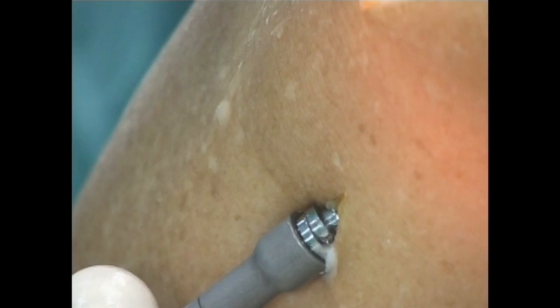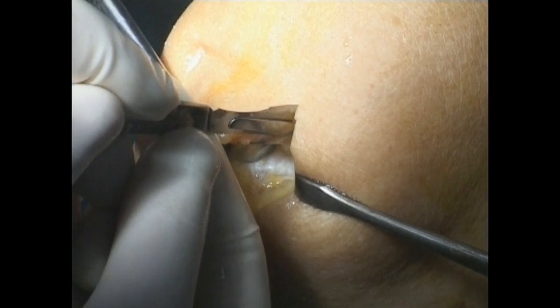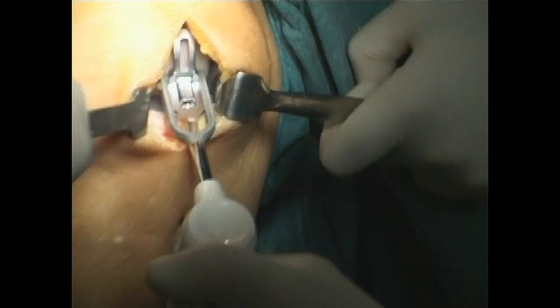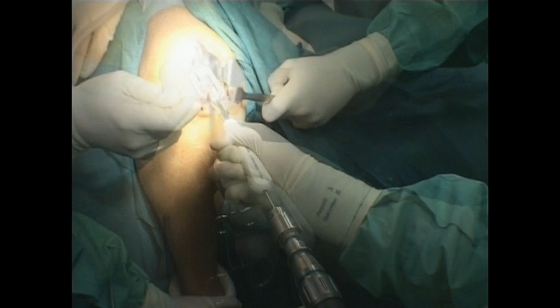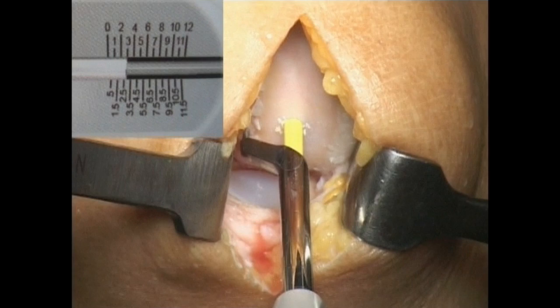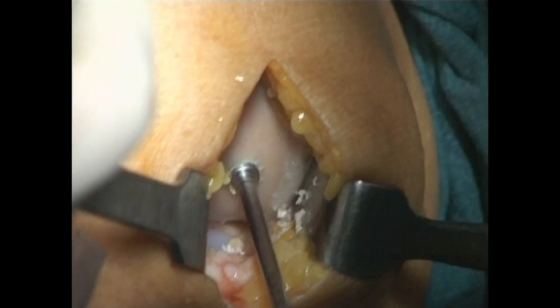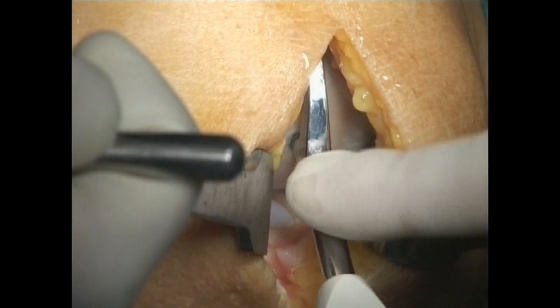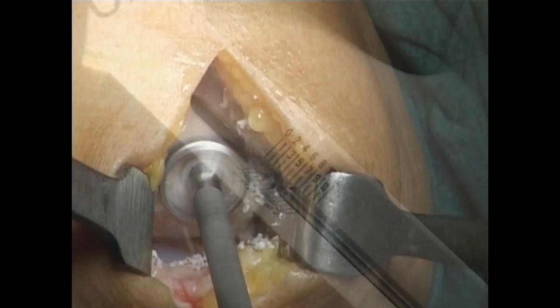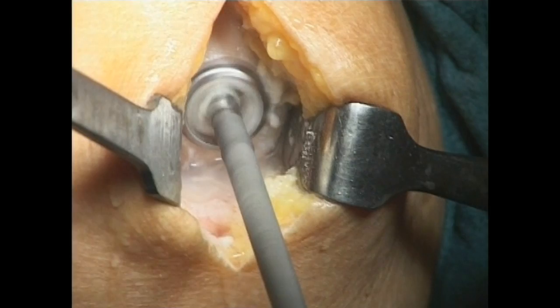The blade stop is removed before implantation of the definitive tibial component, and the femur site is prepared. With the knee at 120 degrees of flexion and working through an anteromedial incision, the femur drill guide is placed on the distal femur in order to develop a working axis perpendicular to the articular surface. A threaded pin is drilled through the central axis of the femur drill guide. The contact probes are placed over the pin to take the preliminary anteroposterior and medial lateral offsets. The femur centering shaft is driven over the threaded pin, and the contact probes are placed over it to take the definitive offsets. The central femur cut is prepared by advancing the reamer over the centering shaft.